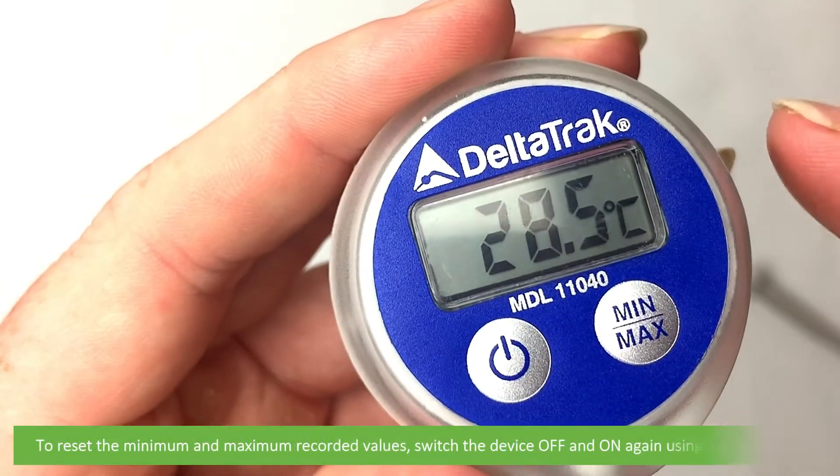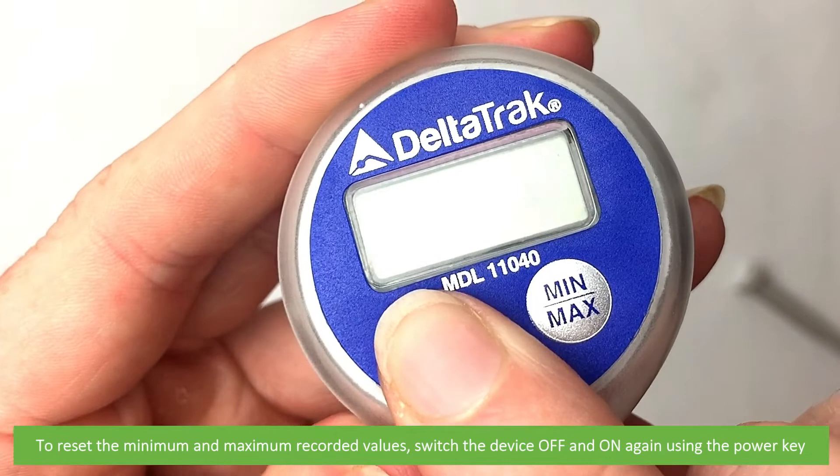To reset the minimum and maximum recorded values, switch the device off and on again using the power key.